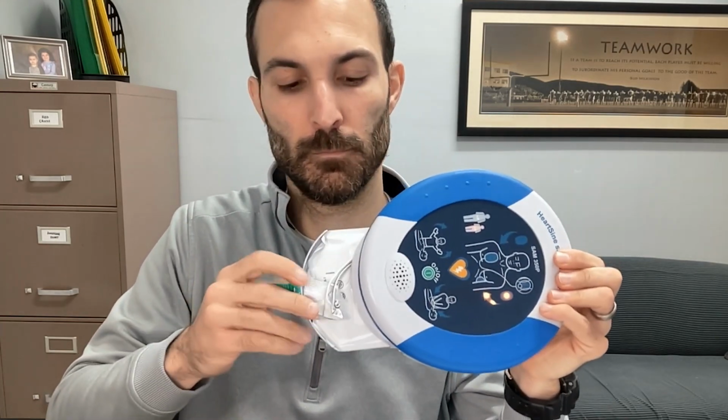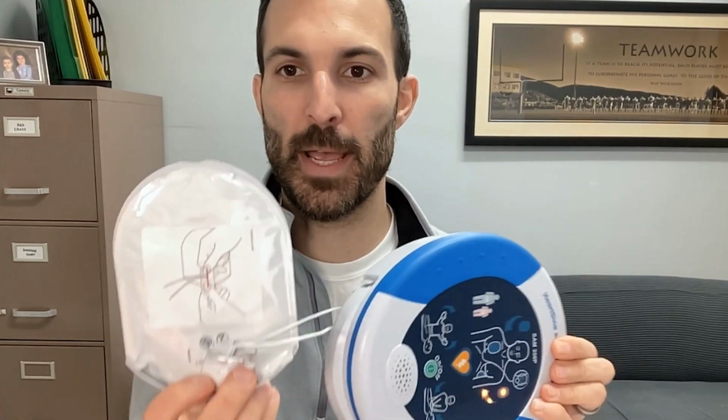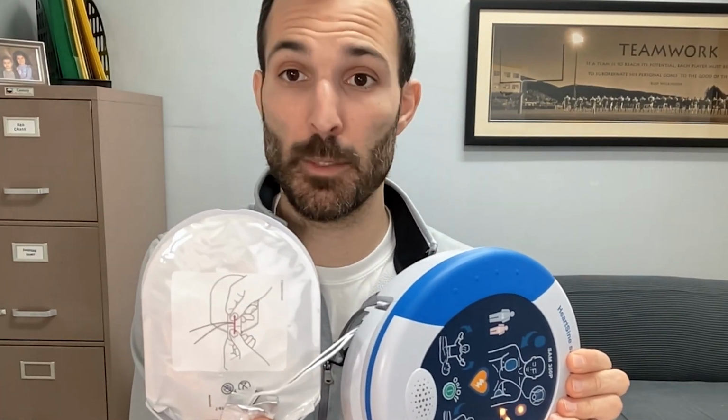On. Adult patient, call for medical assistance. Remove clothing from patient's chest. Remove clothing. Bare skin. Pull green tab to remove pads. Pull green tab. Pads have pictures on them. They show you exactly where to put them. They have pictures on the back. Liner. You can see exactly where to place those pads.